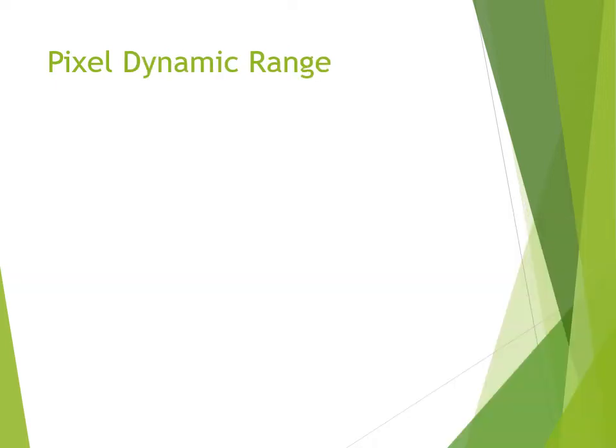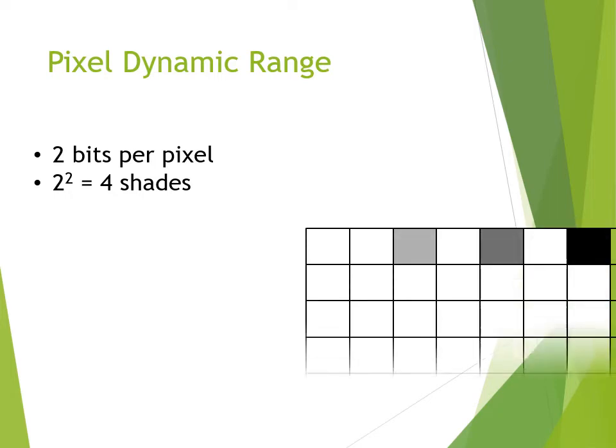Earlier, I stated that a radiographic pixel normally displays a minimum of 4,096 different shades of gray. This means that a plate devotes 12 memory locations to store the pixel's density information. Remember that a memory cell can contain either a 1 or a 0. Let's suppose we use a simplified plate that devotes 2 bits per pixel, or 2 memory locations per pixel. This would mean that each pixel could be one of 4 shades of gray. 4 values are much easier to keep track of than our 4,096.